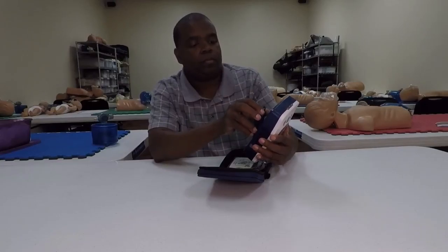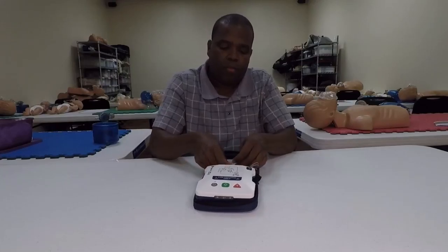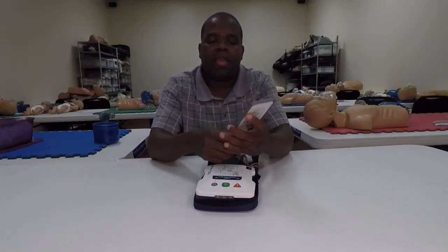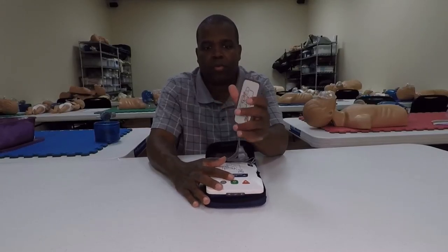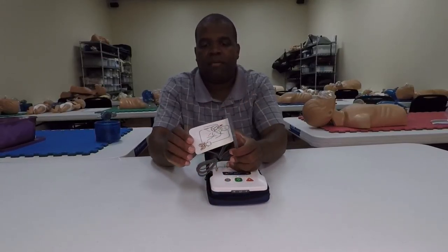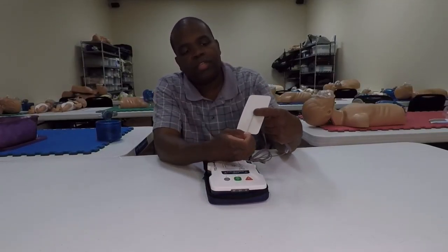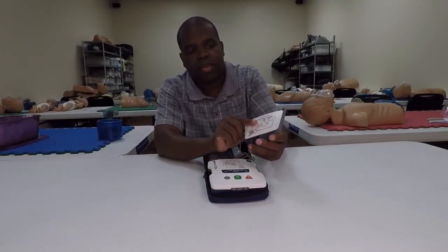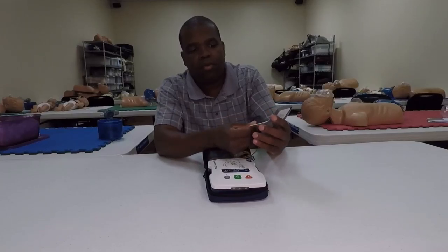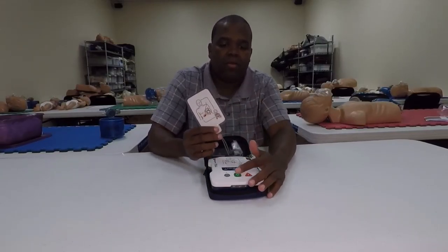Because it is a Prestan AED with pads that typically go on the Prestan mannequin, it still has the same concern I've had before: there's a little sensor on the pad, and that sensor has to be on the mannequin. If you have a softer mannequin such as the Sandy Man, you may have a little bit of difficulty getting that pad to actually read on that mannequin.